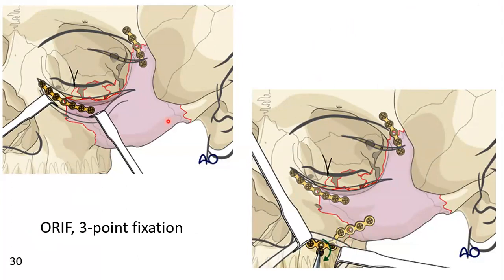Now, we will see here, when looking through the lower eyelid incision, the infraorbital rim plate should be properly adapted. Use a minimum of 5 hole plate with extra holes spanning the fracture line. Reconfirm that the lateral orbital wall, that is the greater wing of the sphenoid and zygoma, has been properly reduced prior to adapting, placing, and fixing this plate.